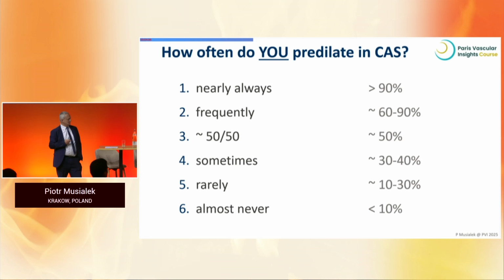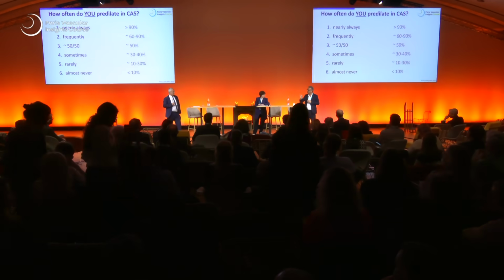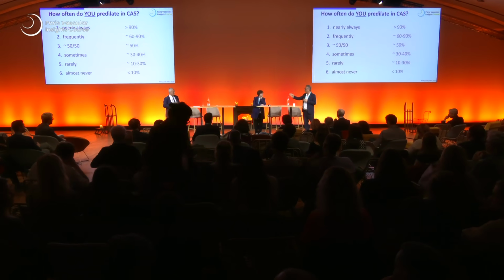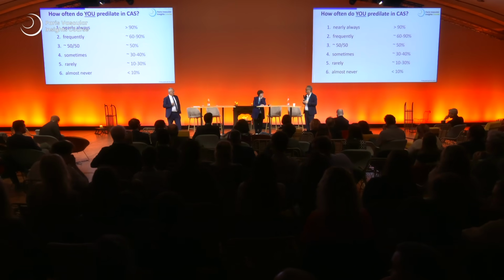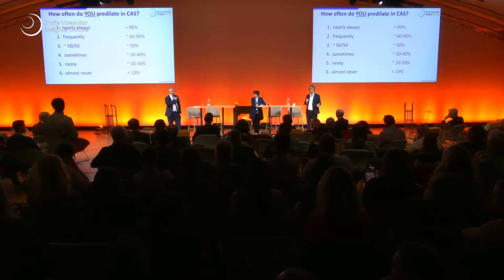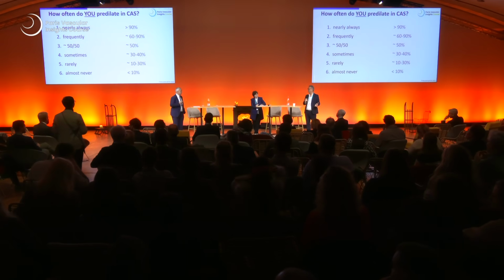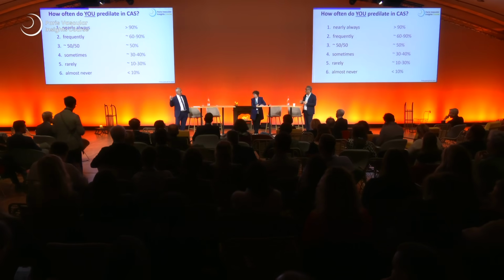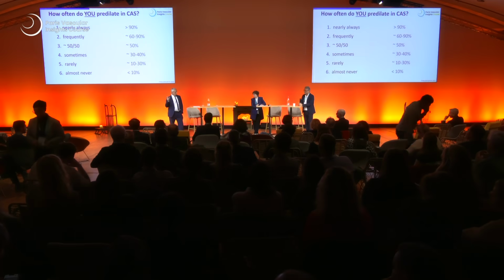And I think if you want to be frank, you need to ask the question like that. What is the rate for predilatation, the degree of stenosis, percentage of stenosis for predilatation? Okay, but I think I can, in fact, challenge you a bit, Eric, because I don't think it's the stenosis severity that matters. Maybe. What matters is what's in the wall, at least to some extent.